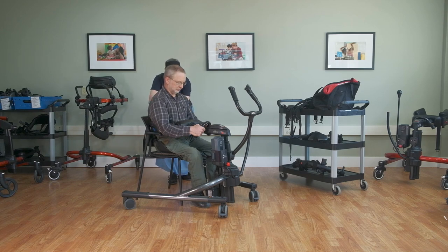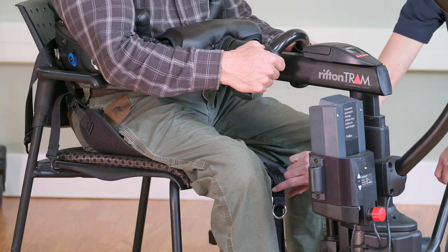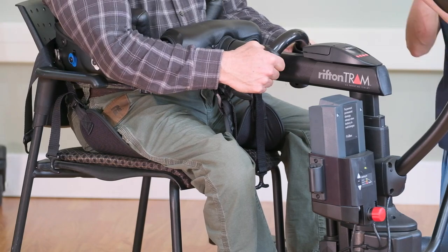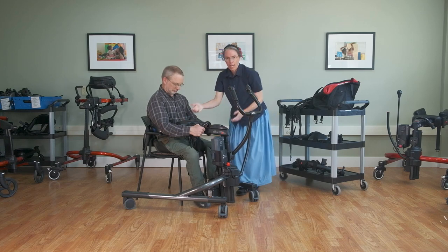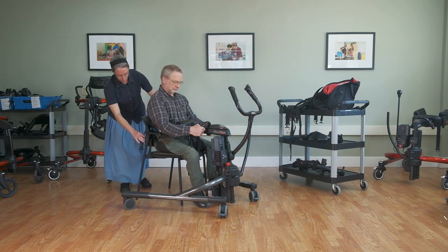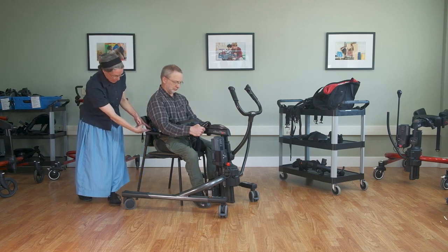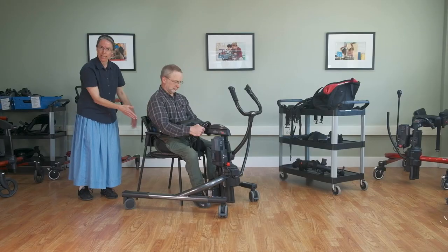We have the front straps, which secure onto the yellow clips in the front. You basically just bring that right up and clip it in place. It's possible to also cross them in the case of an individual who might be wider or stockier and you want to contain their legs. Just before you lift, you really want to make sure that all your straps are snug — if there's a lot of slack, the body support system will raise up under their armpits and they'll be sagging down on the strap.